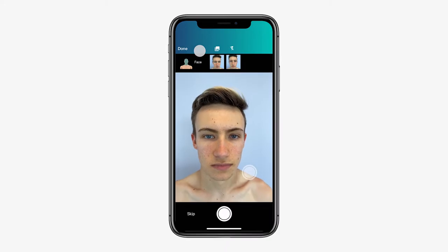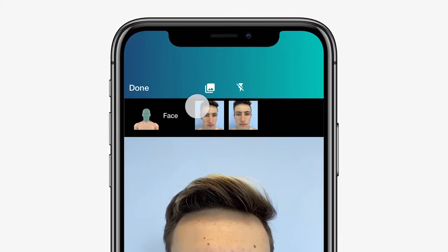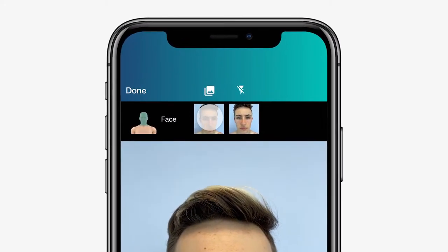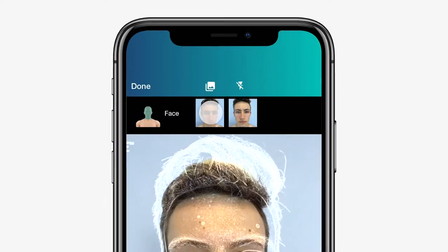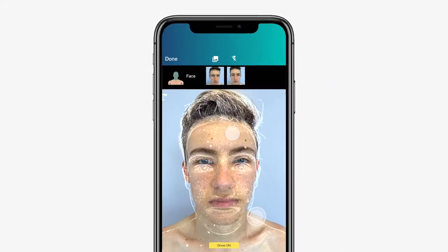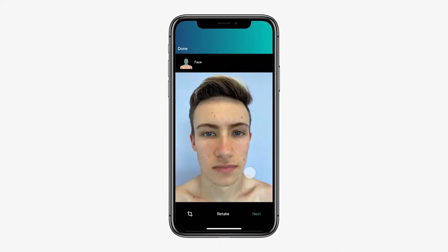Previously taken images will appear at the top of the screen where, if tapped, a silhouette of the image will appear to assist you in taking a new image as close to the old one as possible.